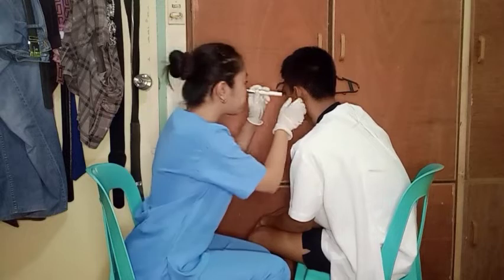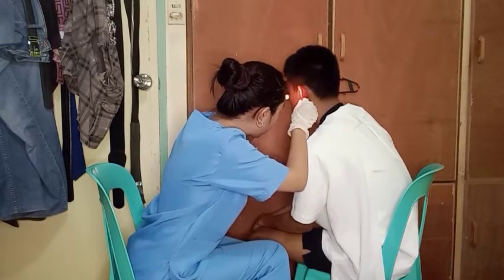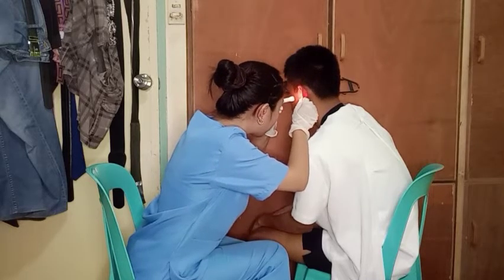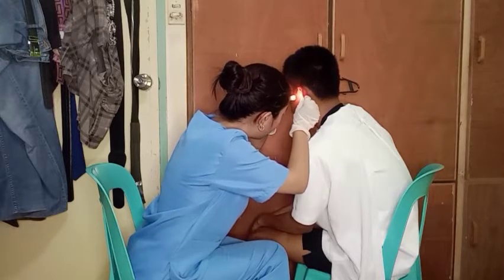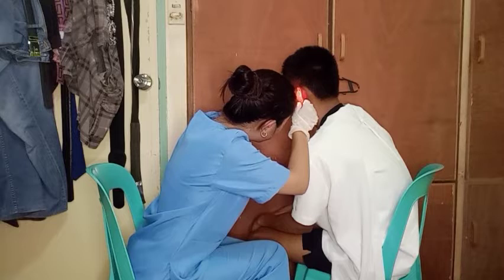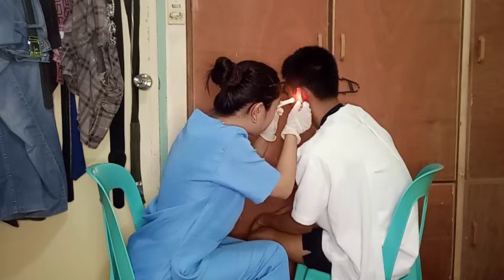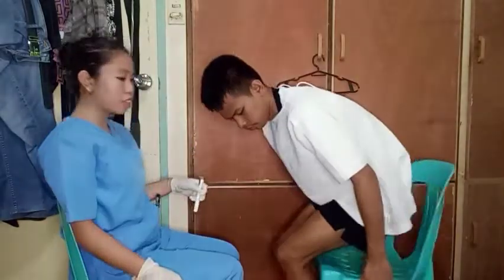Okay, sir. So there is also the presence of hair. And I can see the presence of cerumen. There is also no strange discharge. And you can see the colors are even. So both of your ears are in good shape, sir.